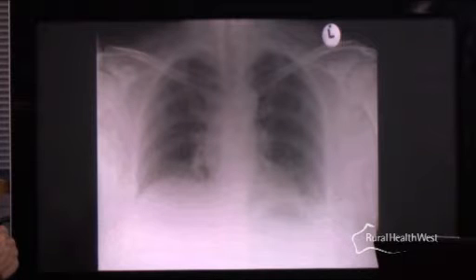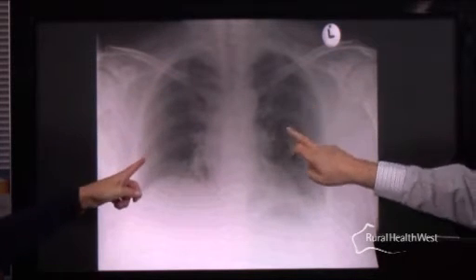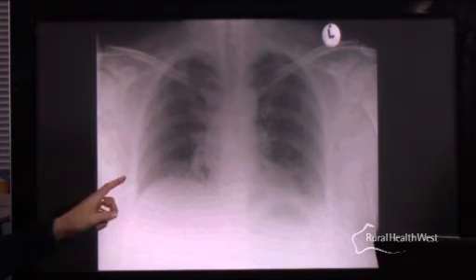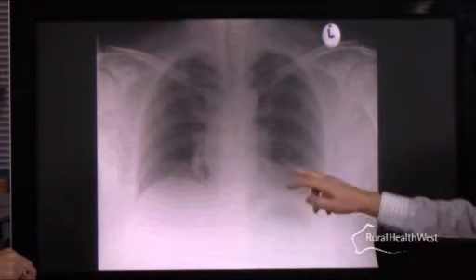The other thing to look at would be to count the number of posterior ribs which are present, and it's nice to get down to about the 9th or 10th ribs. So posterior ribs are these ones? Yep, so you've got 1, 2, 3, 4, 5, 6, 7, 8, and then you lose it, so it's not a greatly inspired film, and what that's going to cause is all these markings down the bottom to be all clustered together, and it's going to be very hard to know whether the patient's got a pneumonia or whether it's just all the normal bronchovascular markings just being basically compacted together. Mm-hmm.